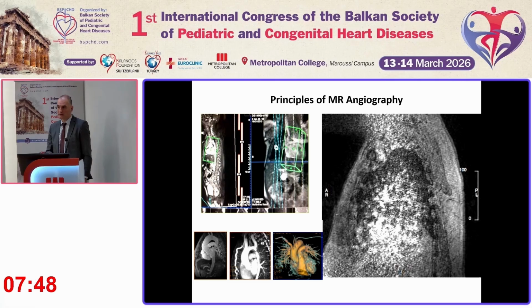This could be part of surgical planning as well. This could be part of 3D modeling, as I heard earlier, 3D printing as well. There are studies where, with the use of MRI, we can produce 3D models, printed models.